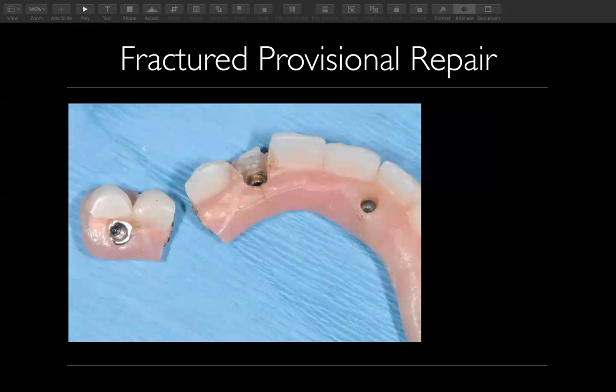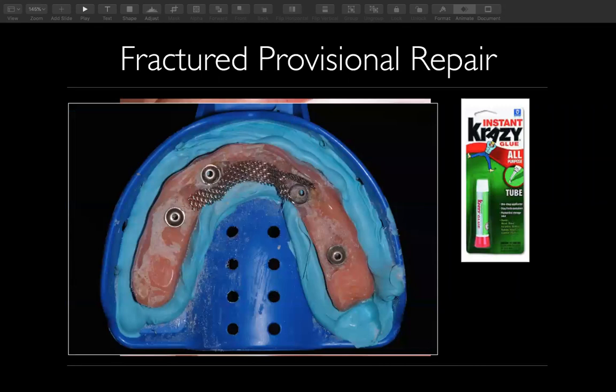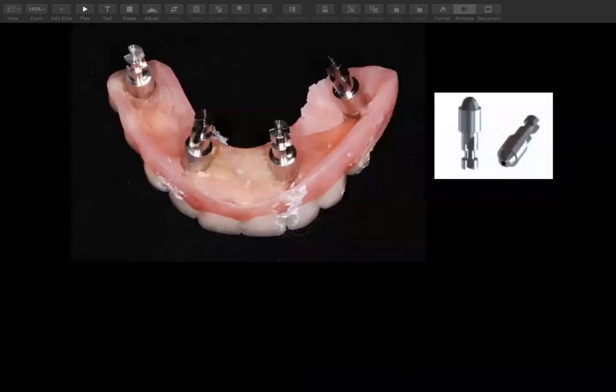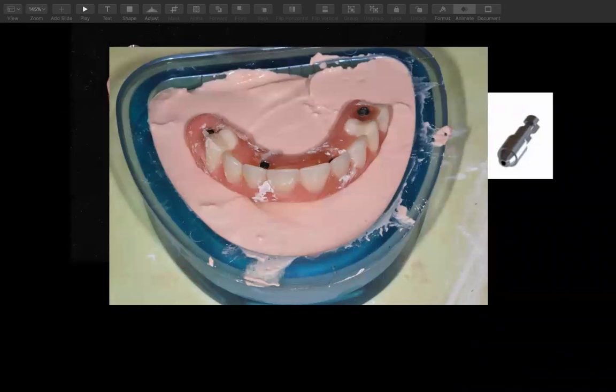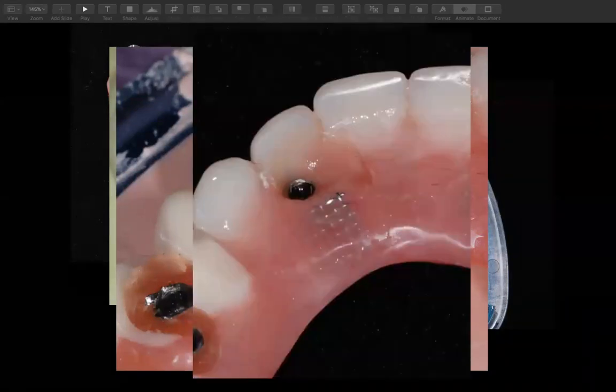Even when I went to Nobel to learn Nobel Clinician, they talked about this. This isn't their slide, but they had a similar slide: if you're going to get into this game, then repairs are going to be a part of doing all-on-4s. Temporarily, a doctor could crazy glue that in. They could take an impression and pick that up. You can repair it with mesh, which is not my favorite, but these are different things you can do for repairs. You can use a Whip Mix type of fast setting stone. If you're at an office, time is everything, so use a fast set stone. Again, you're making these models for repair.